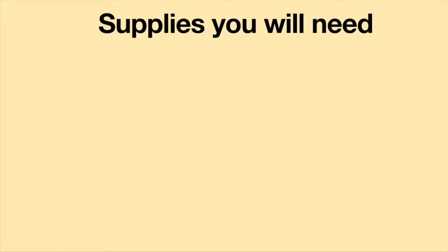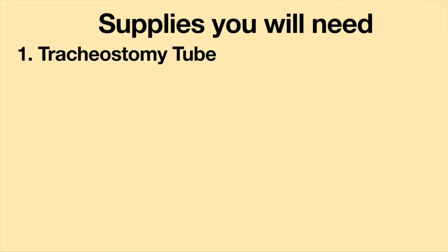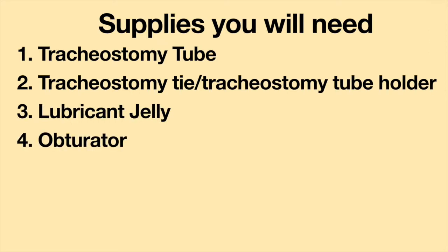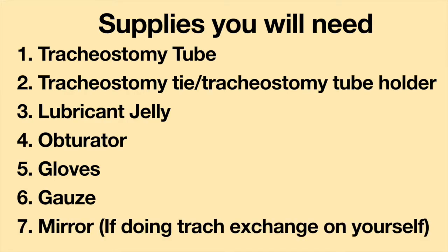When performing the tracheostomy tube exchange at home, you will need the following items: a tracheostomy tube, tracheostomy tie or tracheostomy tube holder, lubricant jelly, obturator, gloves, gauze, and a mirror if you're doing the tracheostomy exchange on yourself.